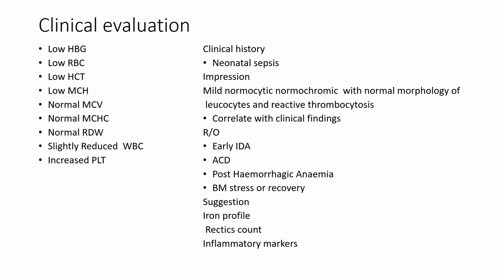Let's not forget that after full blood count results are flagged, the next thing we have to do in a workup is to evaluate a thin film. That's all I just want to add. We are forgetting that part.